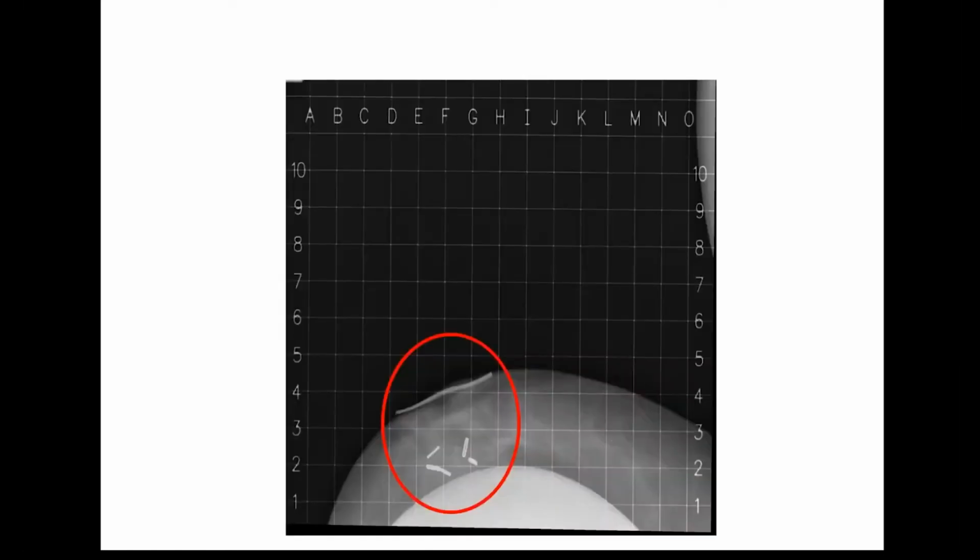These cases are very easy to do with compression. The implant tends to move away very nicely, and we think it's a terrific way to minimize the amount of breast tissue being irradiated in the context of an implant. Next slide.